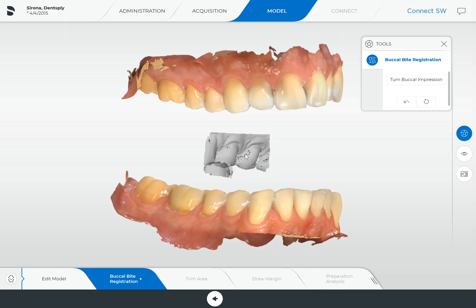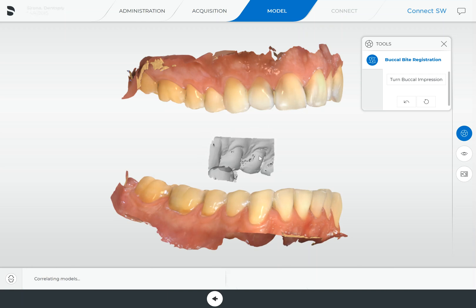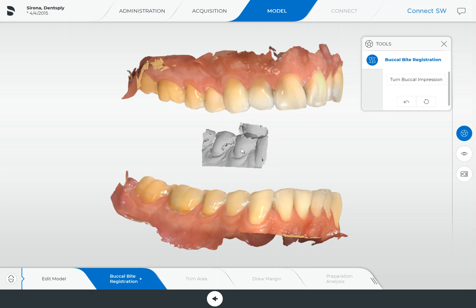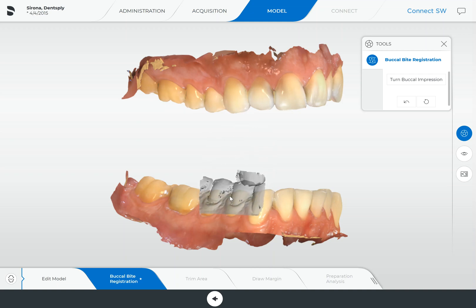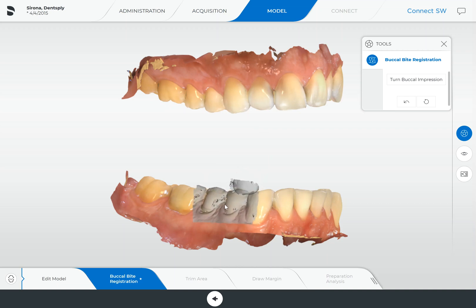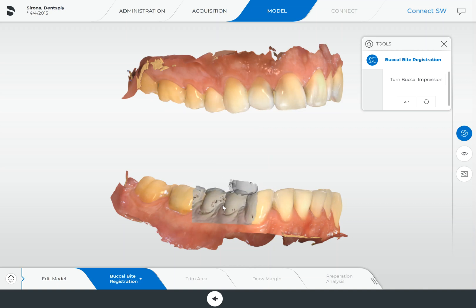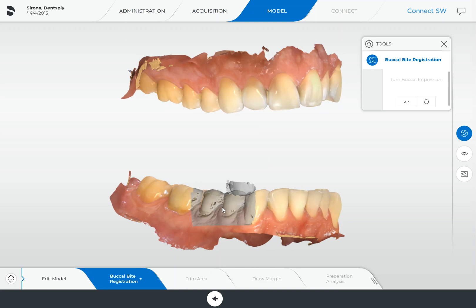So what we do is we simply left click on it, and you can see it rotates itself. If you left click on it again, it'll rotate it back to where you want it. So we just want to make sure we grab it right in the middle, and we're going to pull it down towards our lower jaw first. The great thing is you can overlay it over top of the teeth and see where exactly it aligns on this arch. This one looks like it aligns right about there. You don't have to be bang on — it just has to be pretty close. And you can see the software saying it has enough common data points to attach the lower jaw to our buccal bite scan.